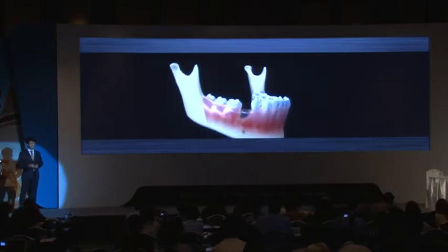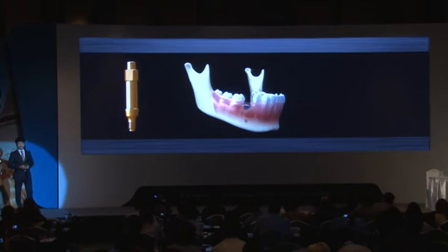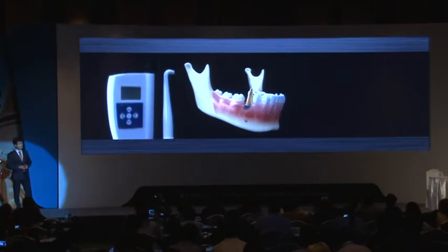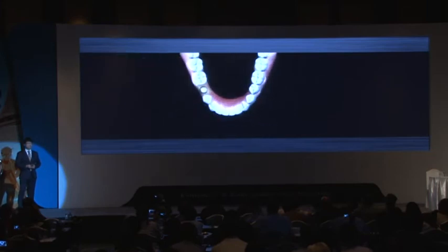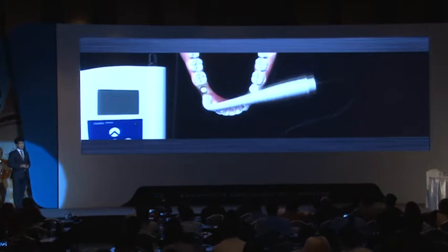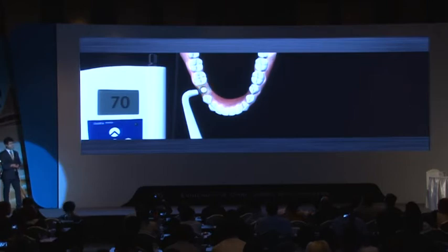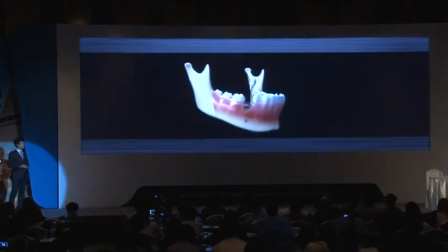Let's see the resonance frequency measurement. This is the SmartPeg, and the SmartPeg was screwed into the implant, and resonance frequency analysis was performed with the Osstell device. Usually, double measurements were made for different directions, and the average of ISQ values was recorded.